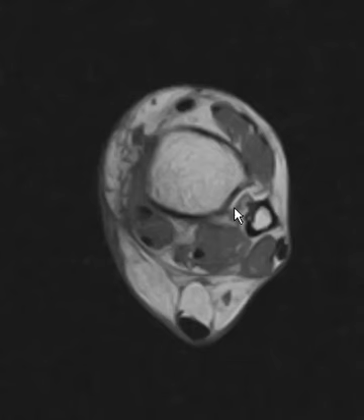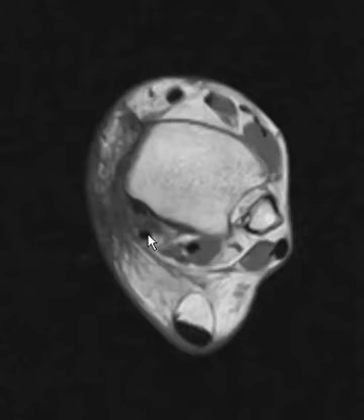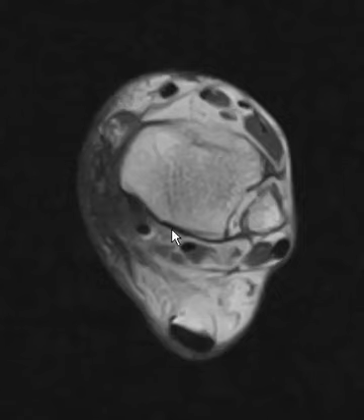So on this view, we see we're high above the ankle joint. This is the tibia, this is the fibula. Here's the Achilles tendon back here. We see our 3 tendons along this side here. We have the flexor hallucis muscle and tendon, flexor digitorum, and over here we have the posterior tibial tendon. And the posterior tibial tendon is the thing that is abnormal.